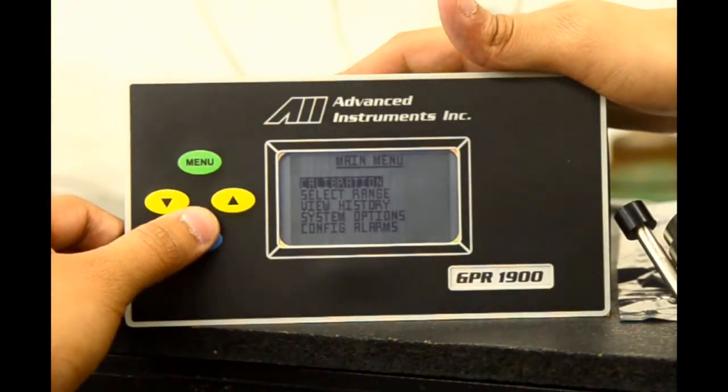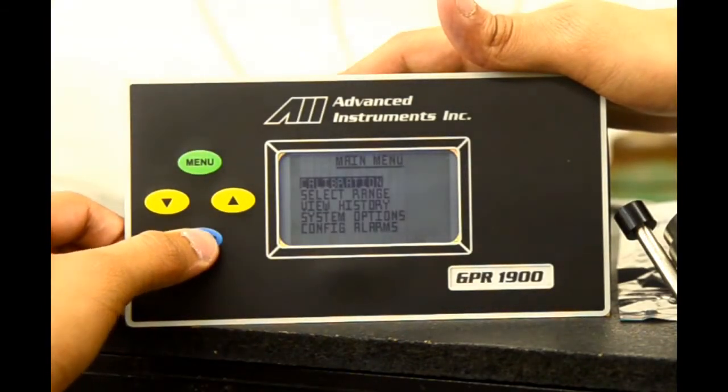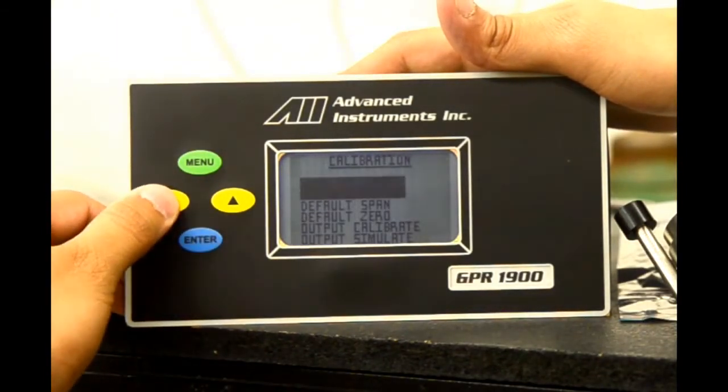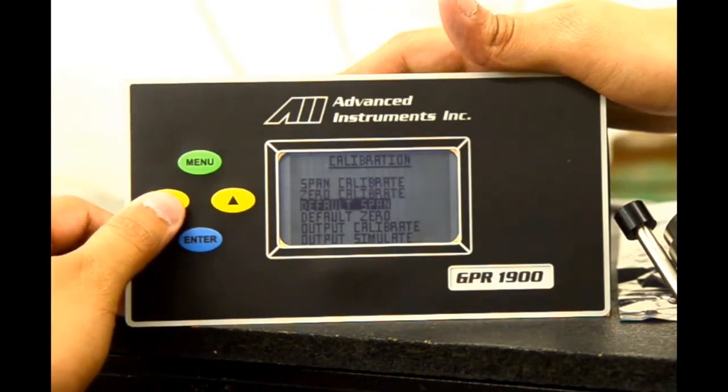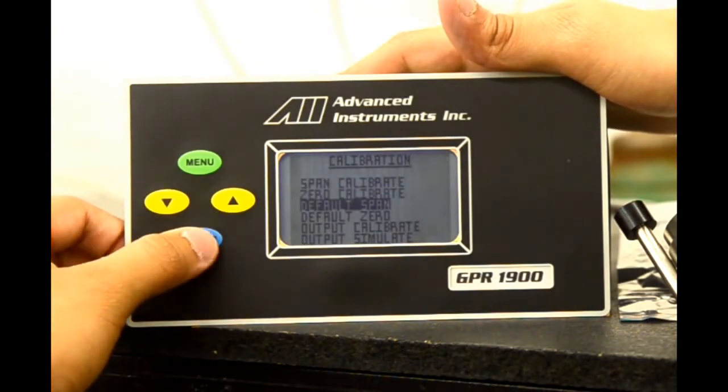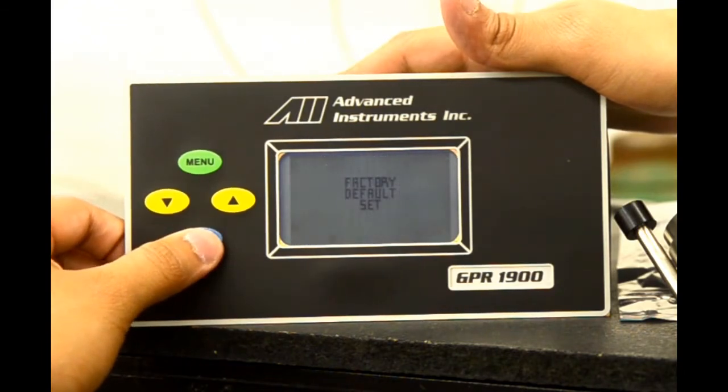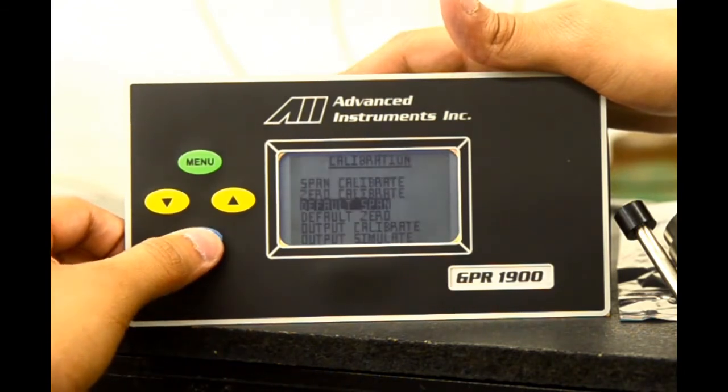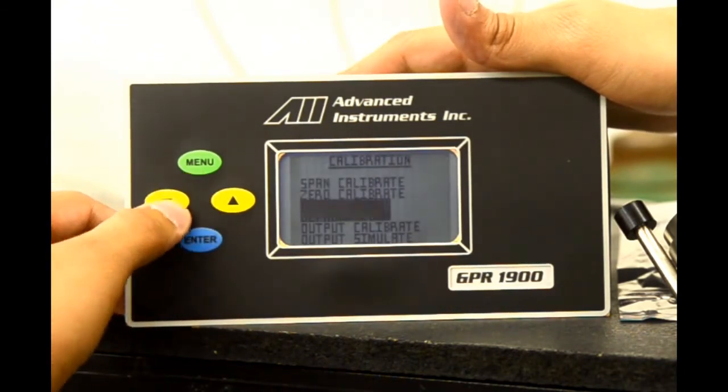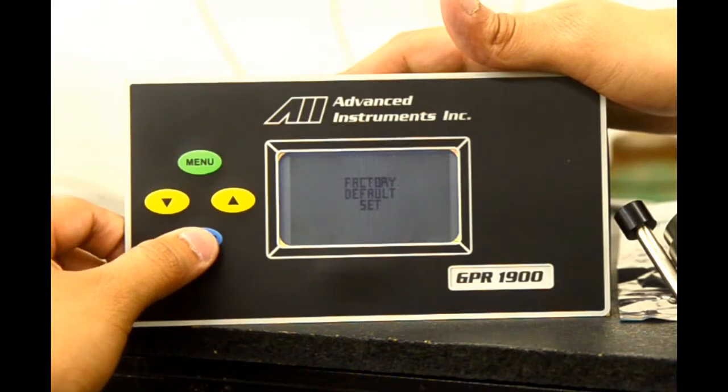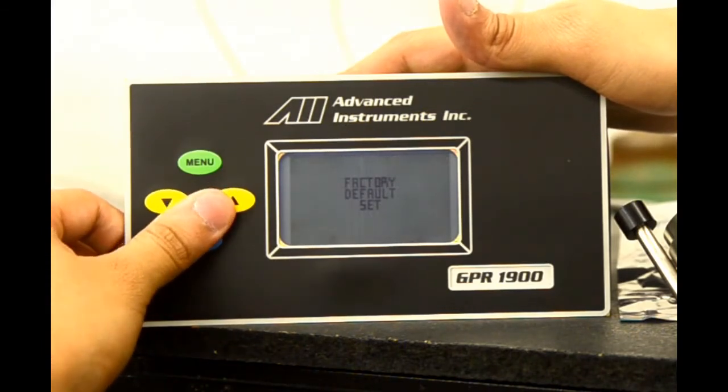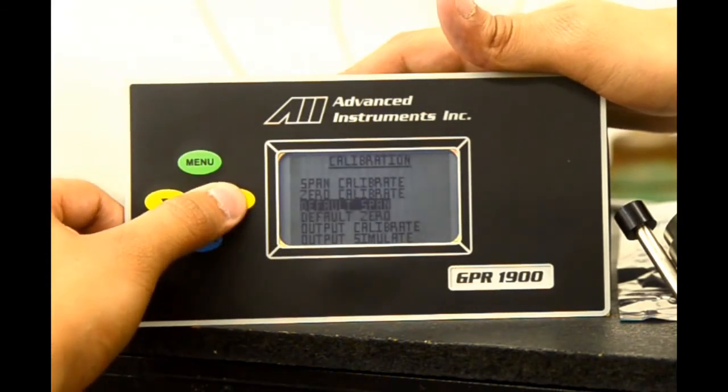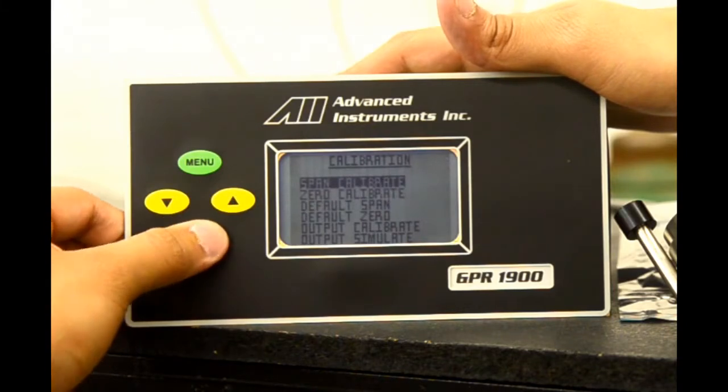We will now perform a calibration. We hit enter on the calibration menu. We'll be taken to the main calibration screen. We'll go down to default span and select enter. This will clear off any prior presets done on the calibration. And we do the same with default zero. As you can see, it will say factory default set. Once these are performed, we can scroll back up to span calibrate and select enter.